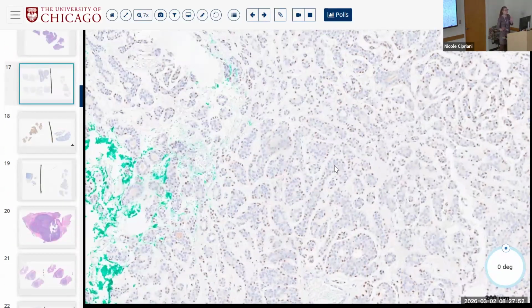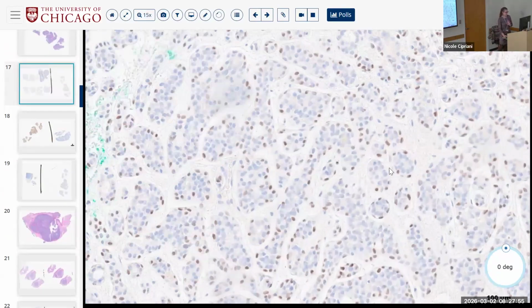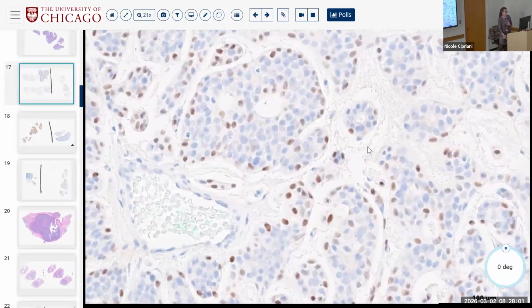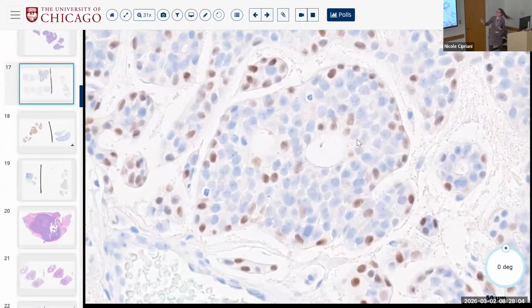So in this case, you have a glorious looking p63 that's present at the periphery of these nests. If you'll note, p40 positive cells at the outer edge of the cribriform space, and p40 positive cells, at least focally, rimming this cribriform hole, which means there are myoepithelial or basal cells sandwiching the epithelial cell compartment and secreting the bluish connective tissue mucin out into the stroma, and secreting the pinkish basement membrane mucoid material into the holes.